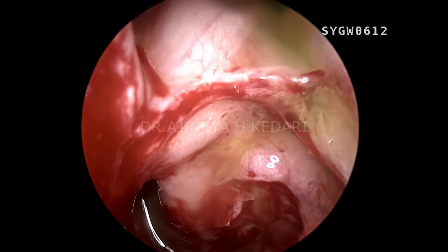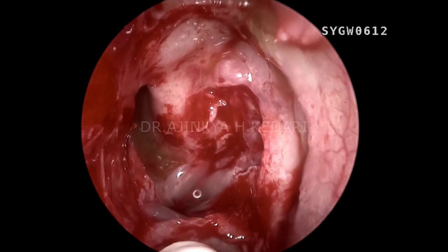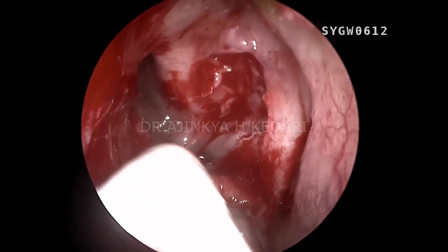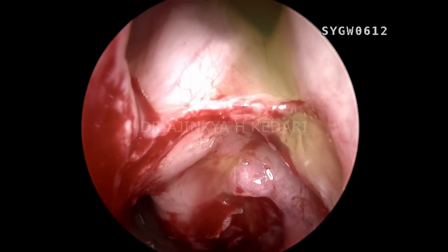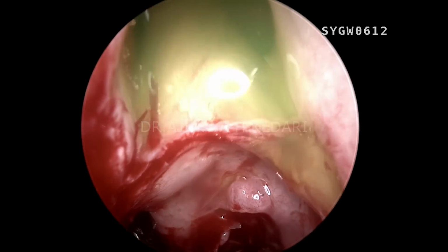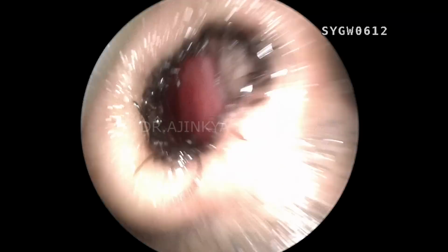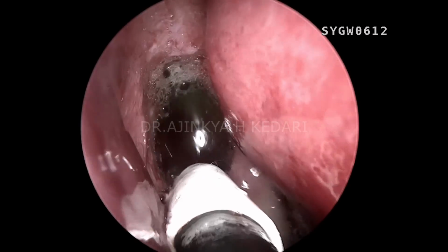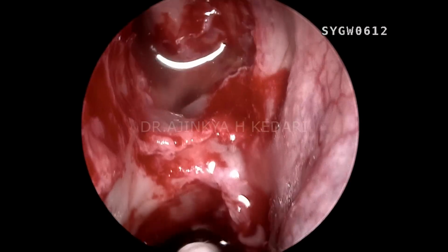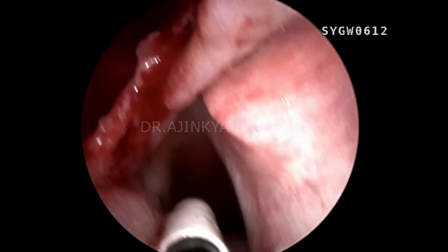Now that's a 0-degree endoscope, and what you can see right now is the lowermost part of the frontal sinus area with an active CSF leak, the CSF stained with the fluorescein dye. You can see the periodic pulsations of the brain, and with that the CSF leak also happening periodically. It gives a pulse every 2 or 3 seconds and minor pulses every second.